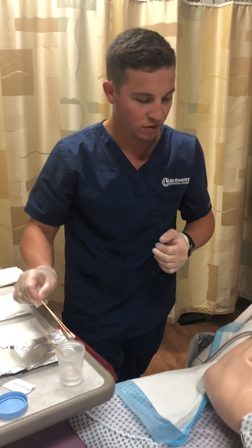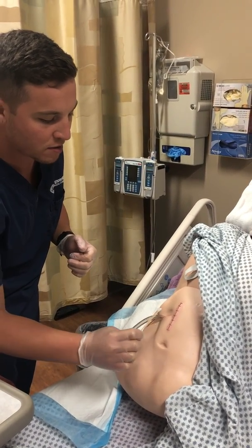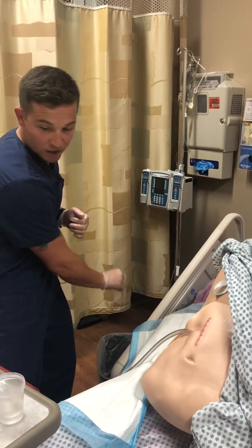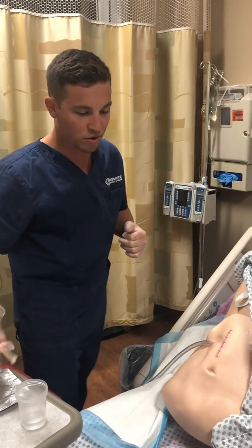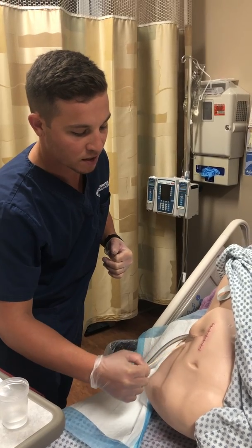So here, like I said, no touch. We're going to start and use a circular motion, working our way out in a circle, rotating. I'm going to toss those in the trash, and use more if need be, going around. Okay, we got our site clean.